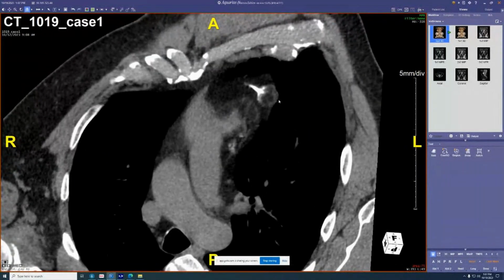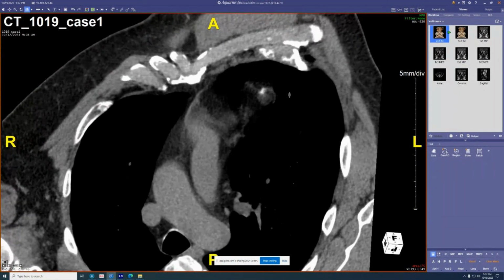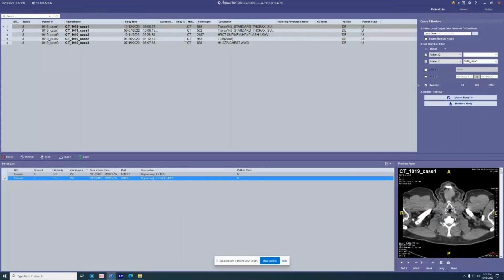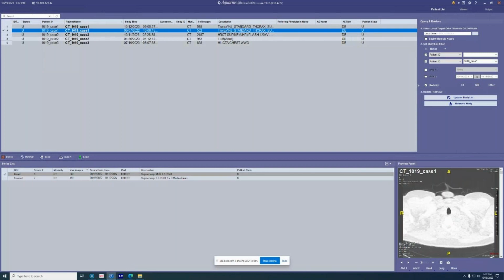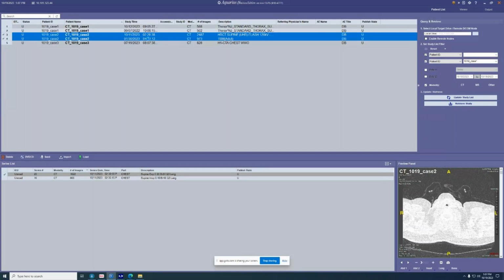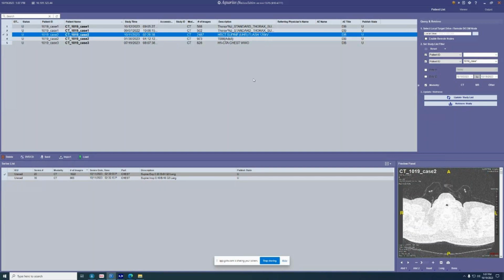I've seen them acutely, maybe three cases, but I just haven't seen one that's healed. I was wondering if anyone thought anything different. Okay, well, that makes you feel better. And here's the old case from a year ago that shows that it's completely unchanged. The only other thing it could be would be a lipoma that torsed, but effectively that's the same thing. So yeah.